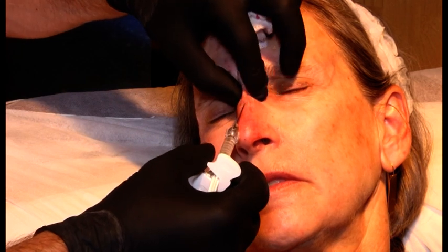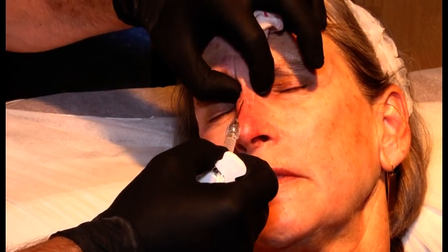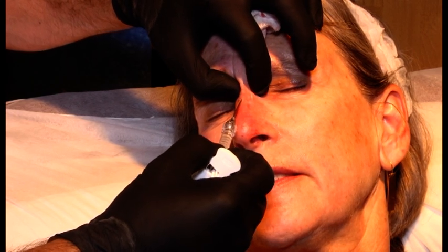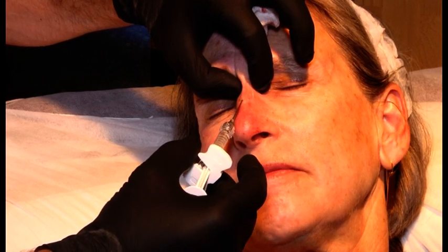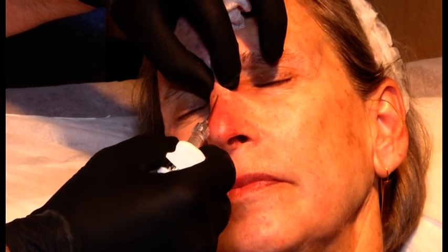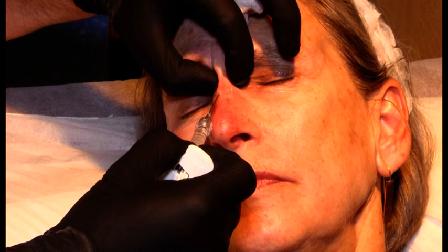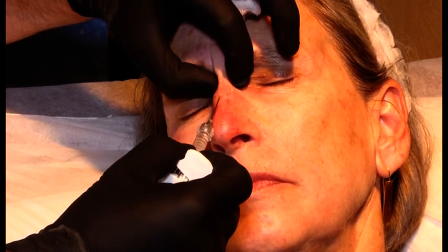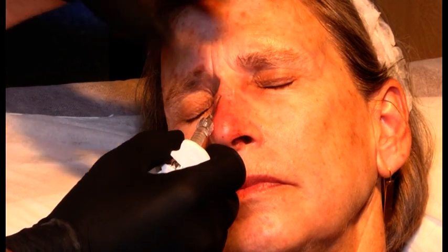And now she's thinking, oh, Riet, I love you, but I hate you for talking me into this. Exactly. And I inject 0.05. You see that I'm also compressing her supratrochlears? 0.025. Again, I re-advance the cannula. 0.025, right? Re-advance. 0.025. And I take my time.